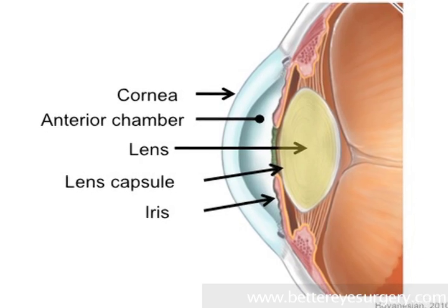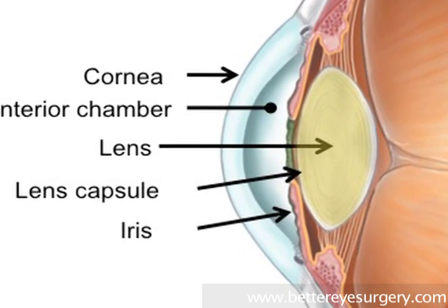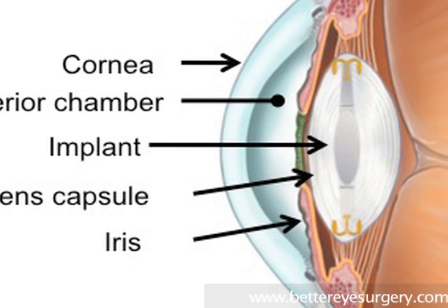In a modern cataract procedure, the surgeon removes the lens of the eye through an opening in the front of the lens capsule. This leaves behind the capsule itself, and into this capsule we put a new lens implant that will remain in the eye for good. The whole challenge in cataract surgery is to remove the lens without damaging the lens capsule.